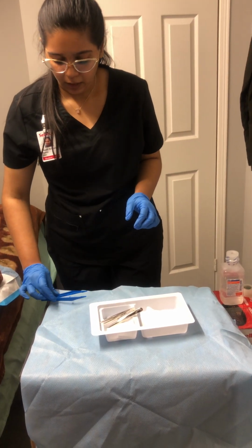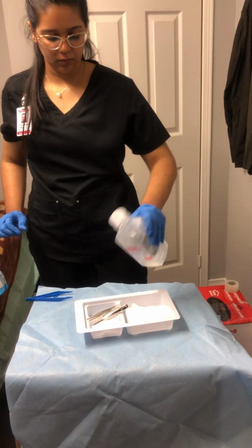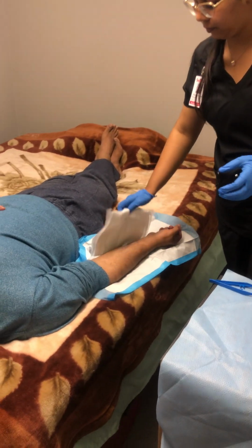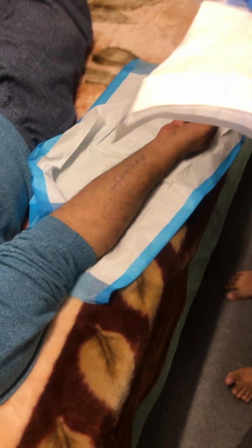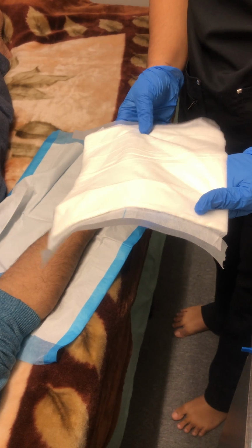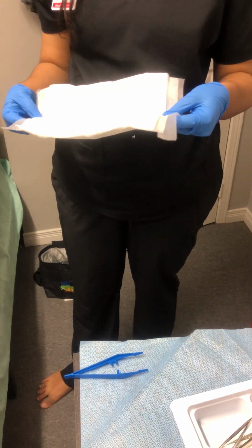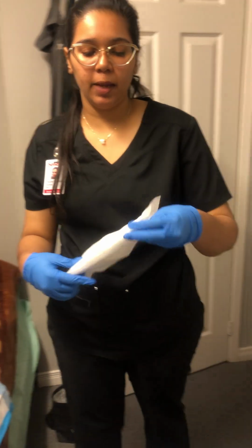We will keep it on the edge. Now I will pour the saline solution. And now we are going to remove the dressing. Upon inspection we can see there is no blood. There is serous, that is clear fluid, that can be seen on the dressing. In a generally ideal environment we would throw this dressing into the garbage bin, but I do not have another dressing pad, so I am going to reuse this and keep it.